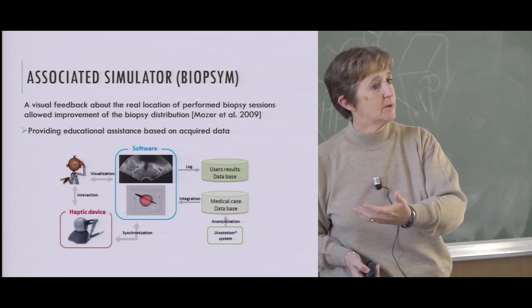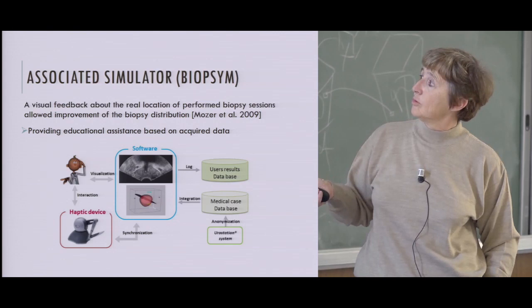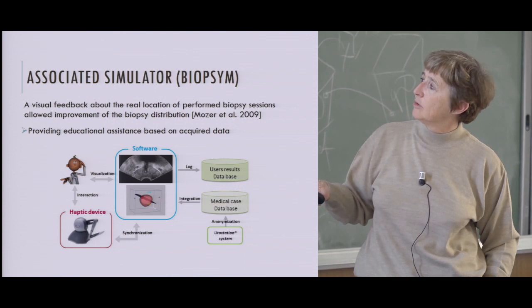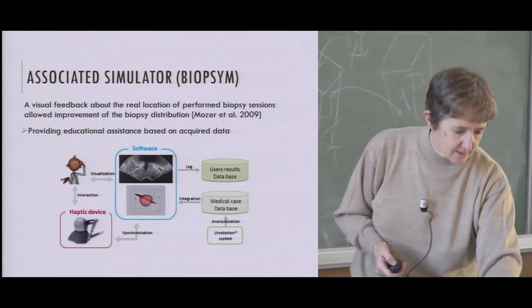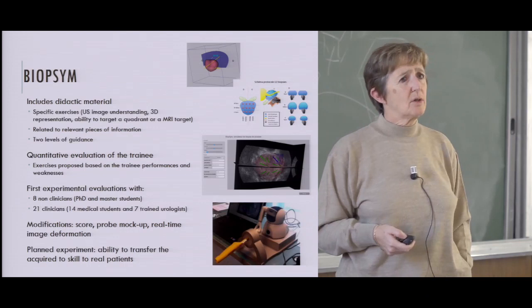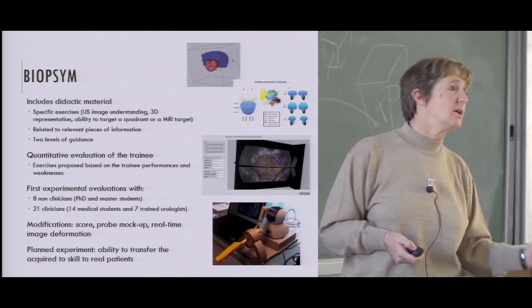So we decided that it could be really interesting to use all the exams that we have recorded to build a simulator. So we have this kind of device with this object which mimics the ultrasound probe. And when the operator moves this object, it computes the image from the database. And so he can play with that. And so we have developed a simulator with some specific exercises to be able to understand ultrasound images, and to provide specific assistance, depending on the result of the training. And so at the end, we finished with a system like that.